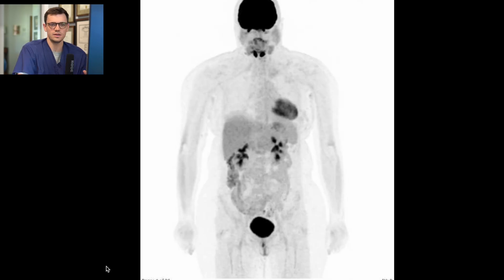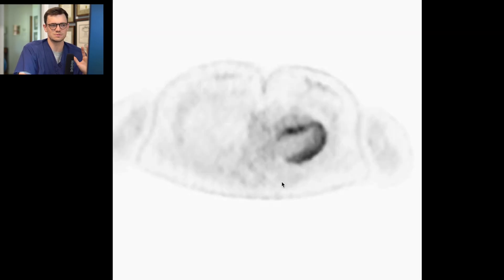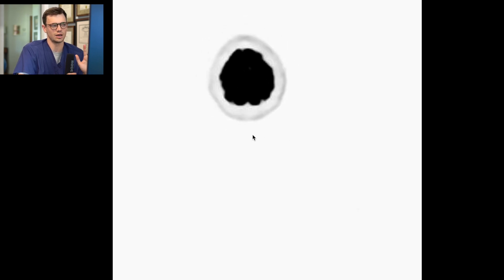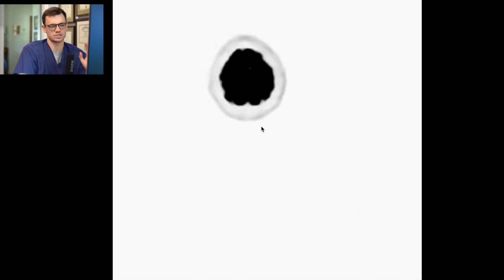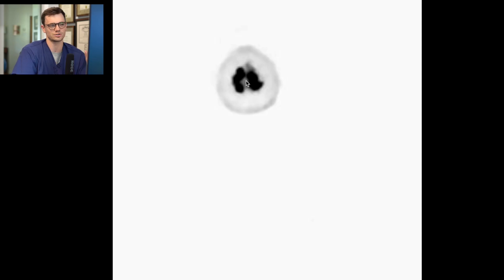This is what I look at first. I then pull up the PET images — these are the axial slices of the actual PET data measuring tracer uptake. I go all the way to the top and actually look at the brain on these PET images. You can change the intensity to better delineate anatomy in the brain and get a sense of brain metastases — sometimes you can catch them, though it's very rare. Overall, PET-CT is not a good study for brain mets. If you're looking for brain mets, you want an MRI of the brain with contrast. Nothing obvious here, and again this isn't windowed great.